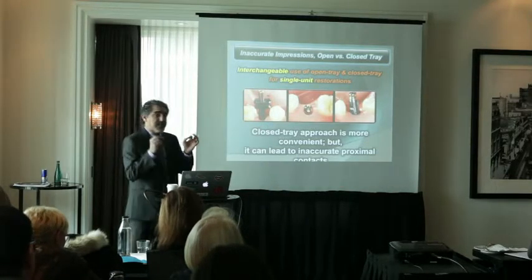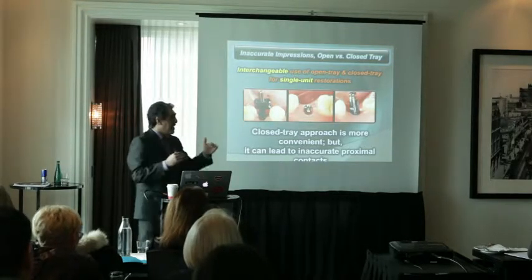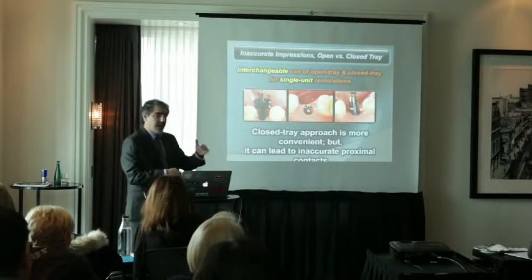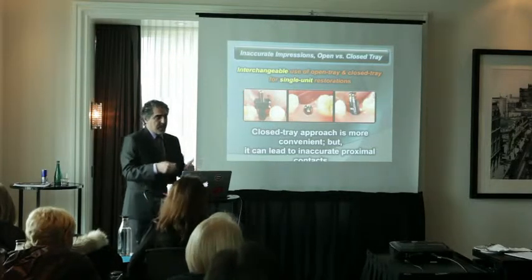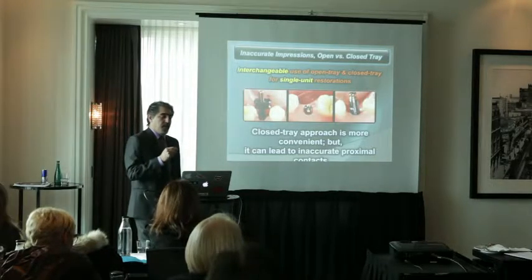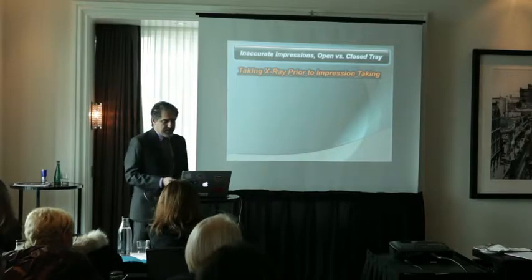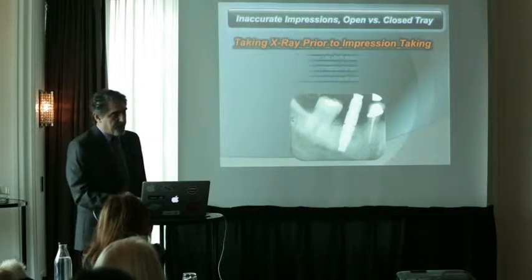So for that reason, especially when you have very deep implants, if the implant is very deep, then the transfer is going to go down quite a bit, and the head is going to end up somewhere around here if you don't have the long transfers. Then your impression is not going to be very accurate. So in those cases, I would recommend going for open tray, even for single implants.